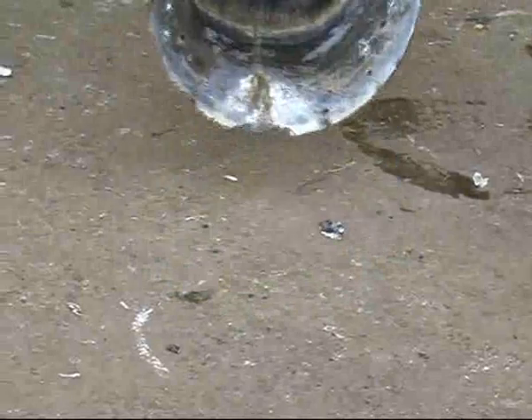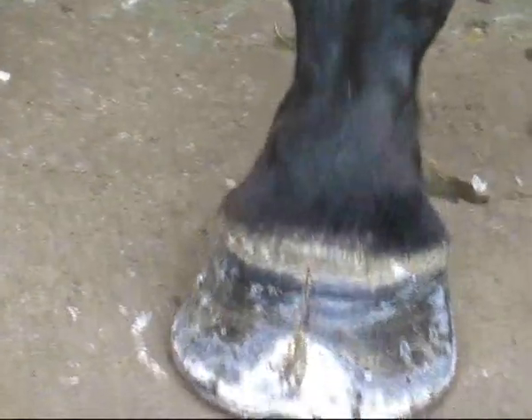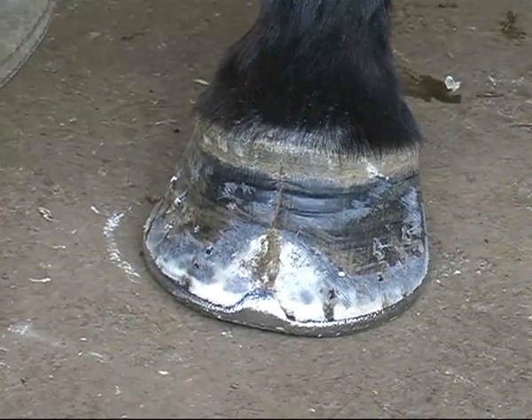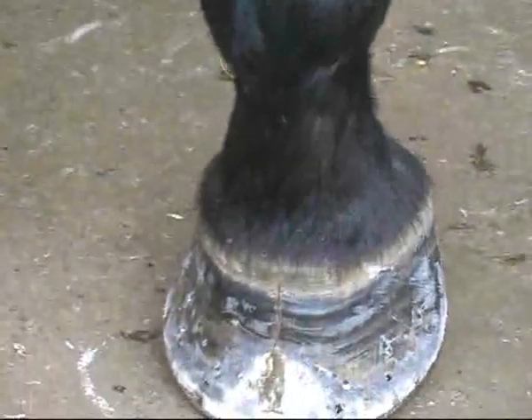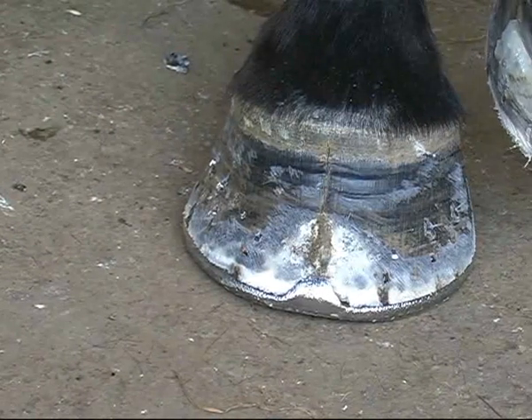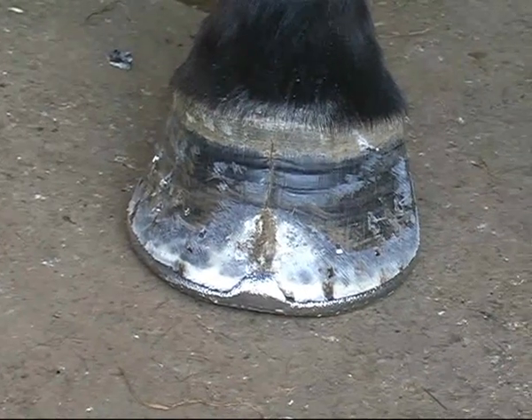We'll just demonstrate the instability in this crack. Stand him on the toe — you can see, I'm unloading it now. You can see how open this crack is, all the way down. I'll let the foot stand back on the ground and I'll lift the other foot up and you'll see it closing up. Can you see how that's closed up? It's open when unloaded — watch it close as I lift the other foot up. The other foot can't do that because there's no crack any longer at the top, but this foot still does open and close. It's unstable and we really do need to help this horse out.